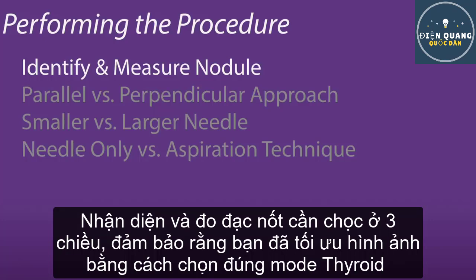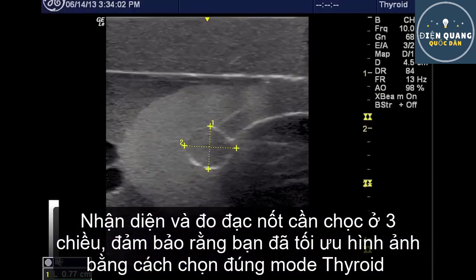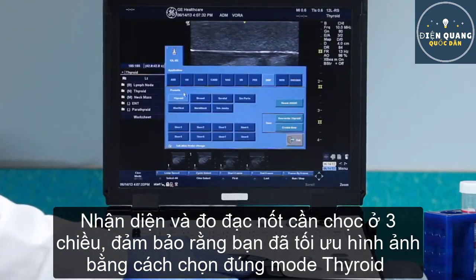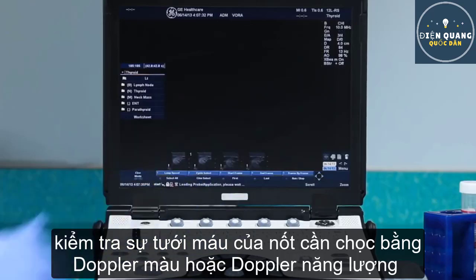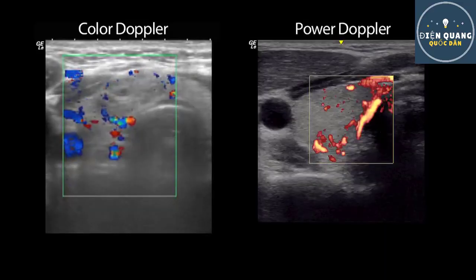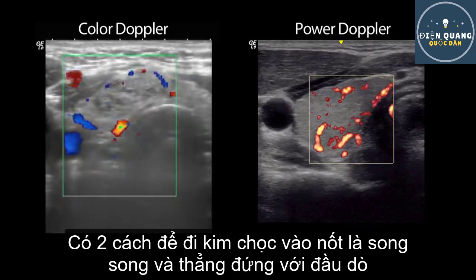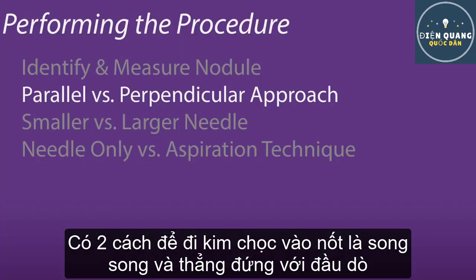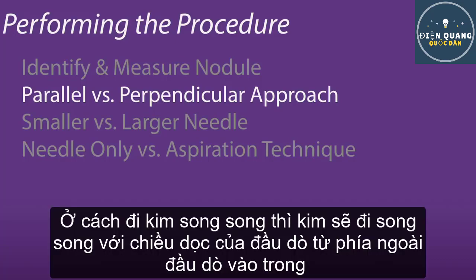Performing the procedure. Identify and measure the nodule in three dimensions. Be sure to use settings that will result in optimal images. Most current ultrasound machines may have a preset thyroid setting. Assess for nodule vascularity with color or power Doppler.